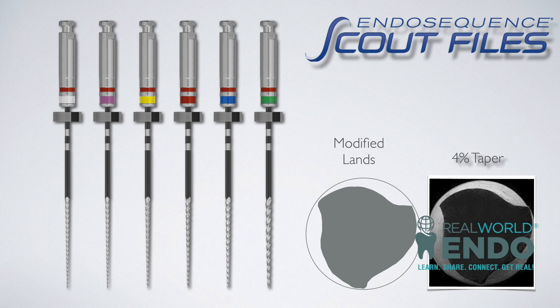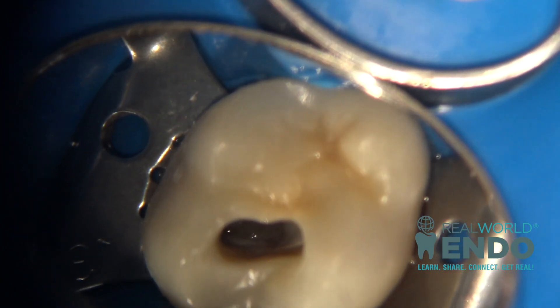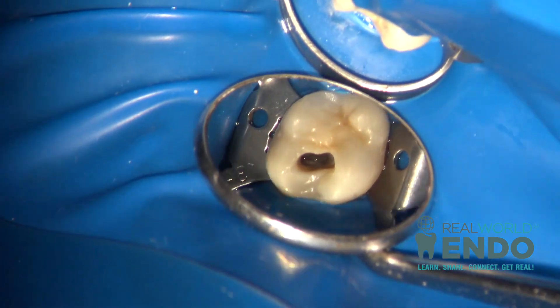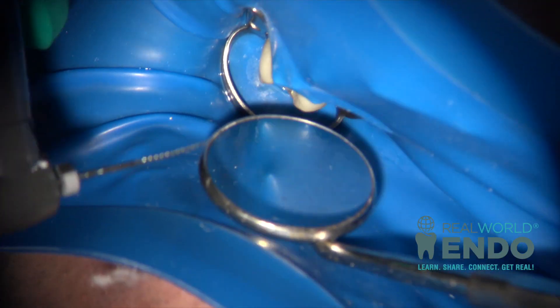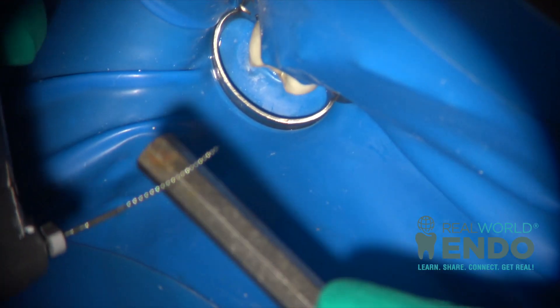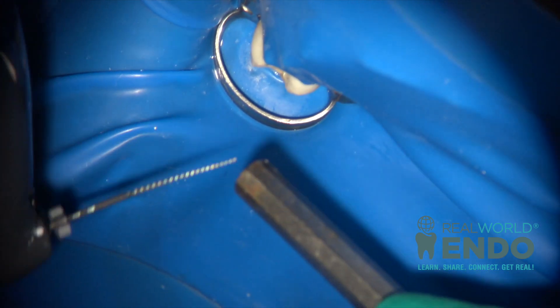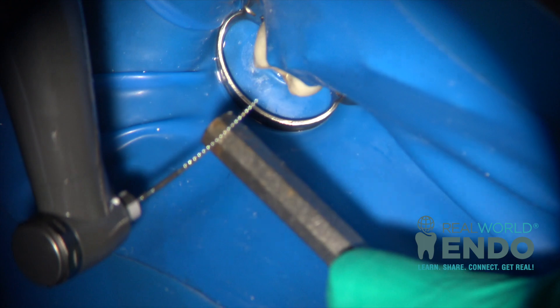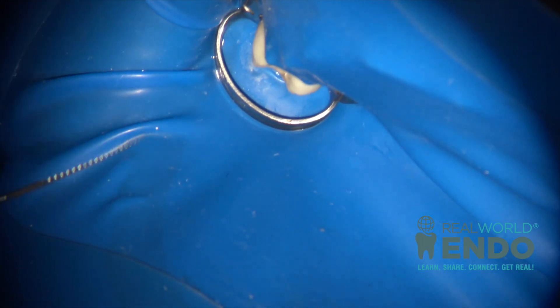Sometimes when you have a small access preparation and teeth with limited access or limited openings, what you want to do is pre-bend your heat-treated files. In this case with the EndoSequence Scout files, the trick is you try to bend it with the back of the mirror — you can even use your finger with a clean hand — but with those methods the amount of bending is limited.